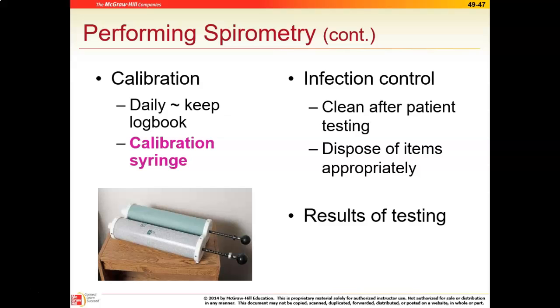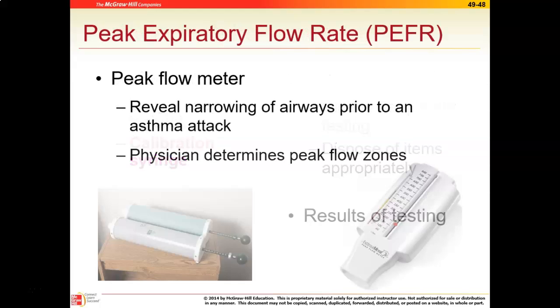Okay. Some of these pieces are disposable and some are not. So if they're disposable, you would throw everything away, as biohazard, or dispose appropriately as your facility directs. Some of the things are not disposable, so you would have to clean them and disinfect them after each use. Okay.